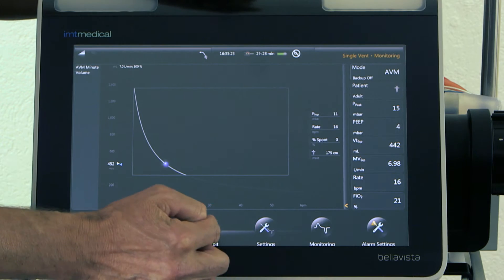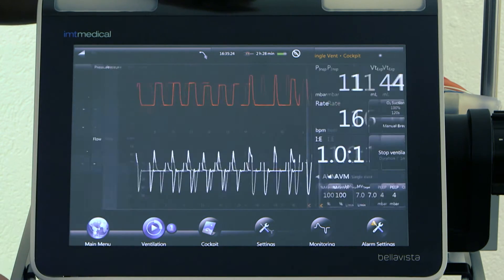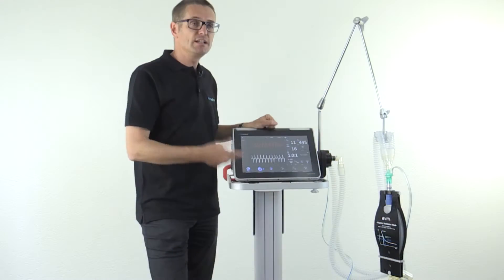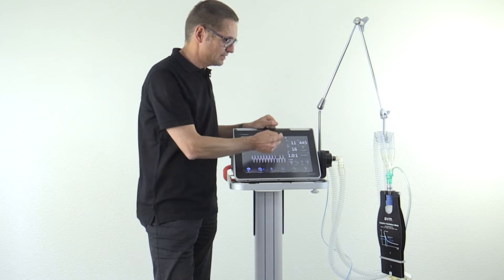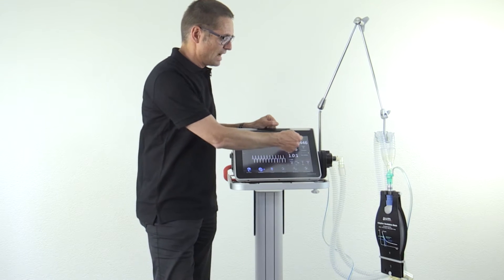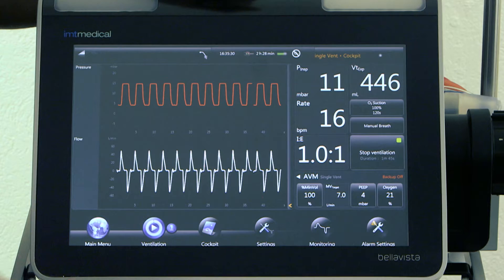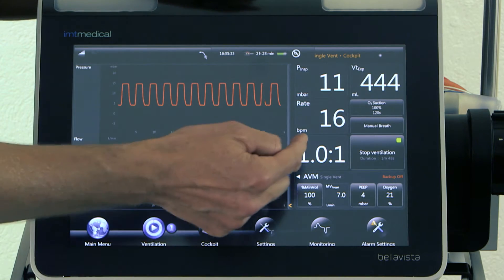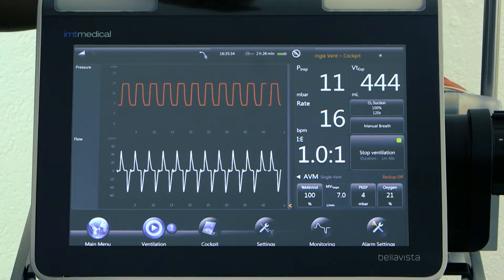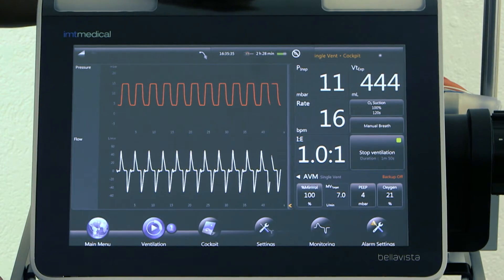Let's go back and have a look at these parameters. The ideal rate for this patient is 16, the ideal tidal volume is around 450 milliliters, and the I:E ratio is about 1 to 1.